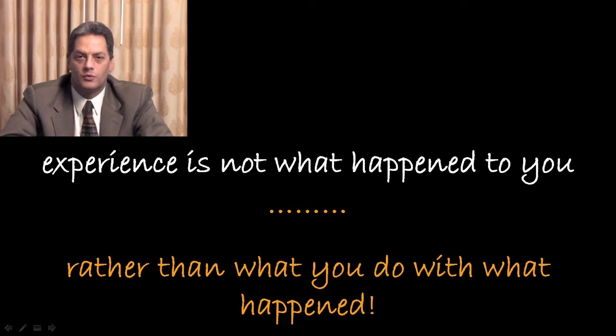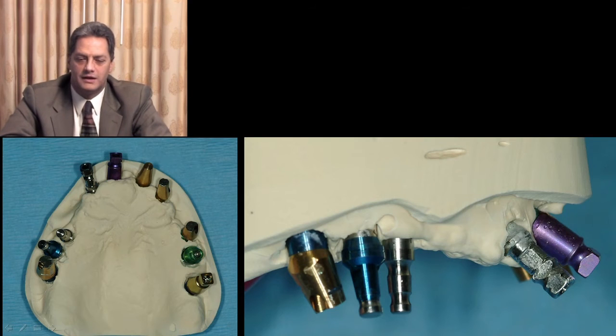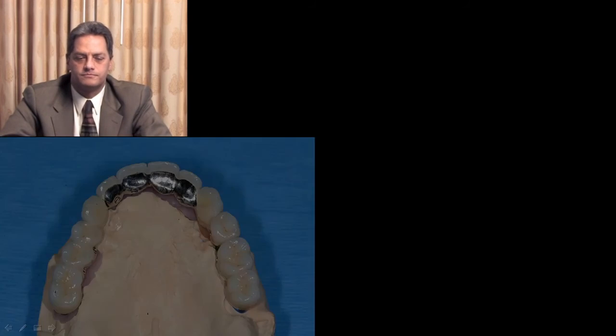So experience is not what happened to you, rather what you do with what happened. Definitely that should be avoided. As you can see here, technically it's quite a challenge, and the only person that's actually happy with this scenario happens to be my lab technician, because he had to customize all the abutments, and we have through lingual screw retained restorations the prosthesis that the patient envisioned in the first place.